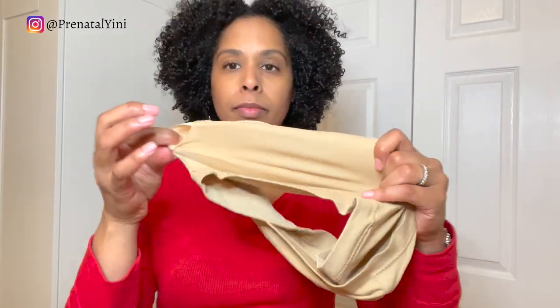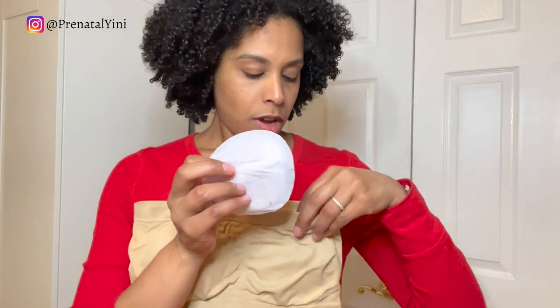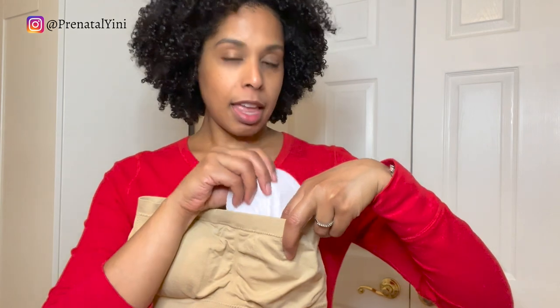The fourth hack is using a bandeau as a pumping bra. You want to remove the padding first, then with a pen mark where your nipples are, take it off, and make a small opening so your flange can fit through. When you're not pumping, you can use a breast pad or nursing pad inside to cover the opening.